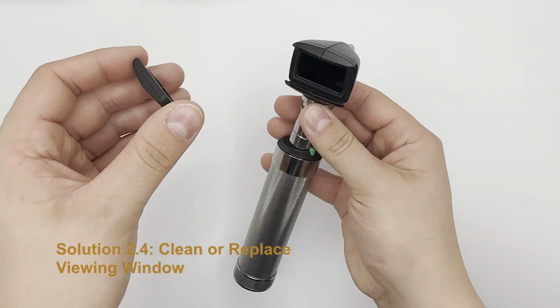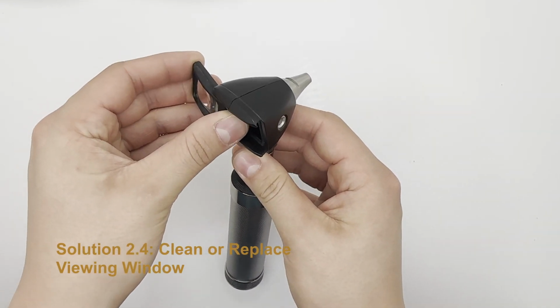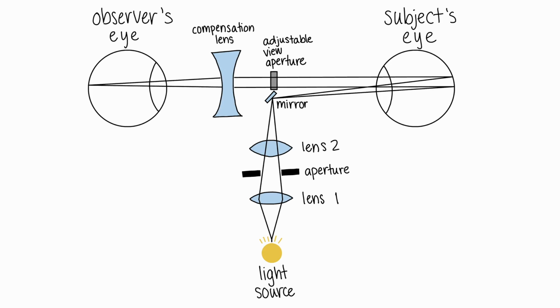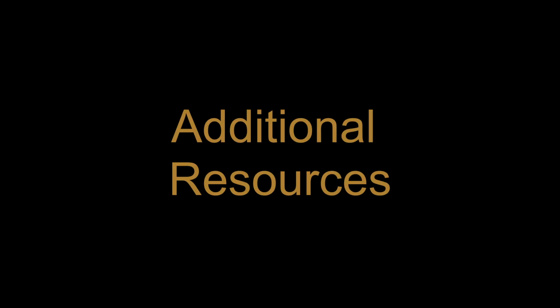If, after these 4 steps, the image is still blurry, then there might be an issue with the lenses or mirrors within the scopes. If this is the case, the entire scope must be replaced. Appropriately sized lenses and mirrors are not sold separately and cannot be replaced manually. For additional information, please consult the service manual of your device.